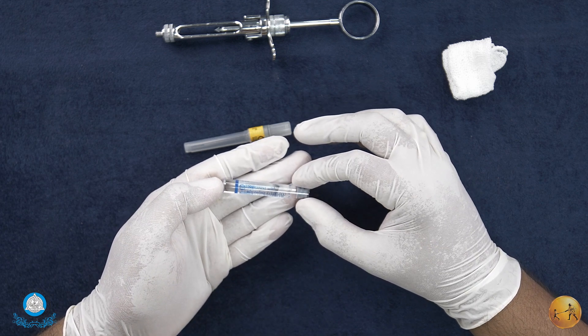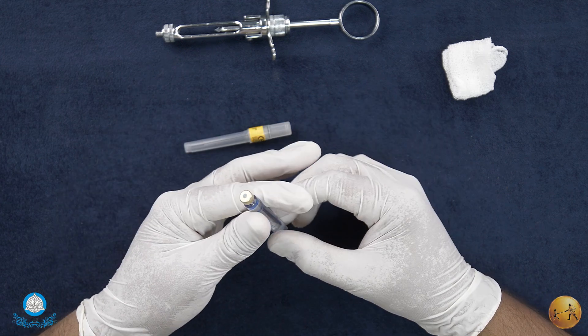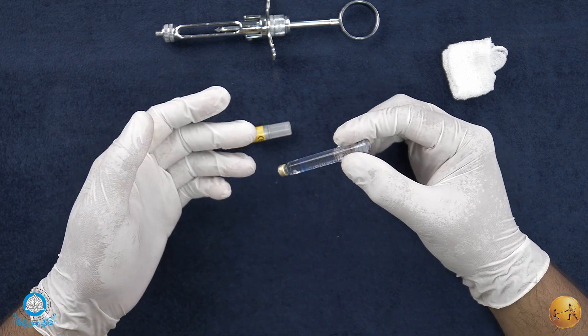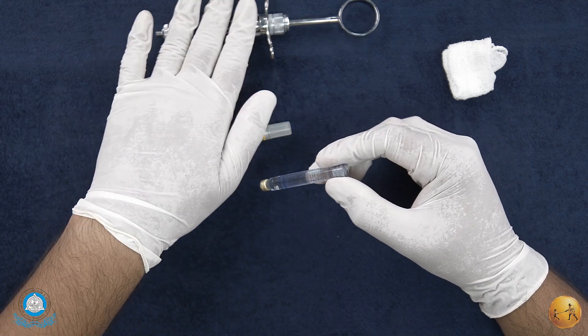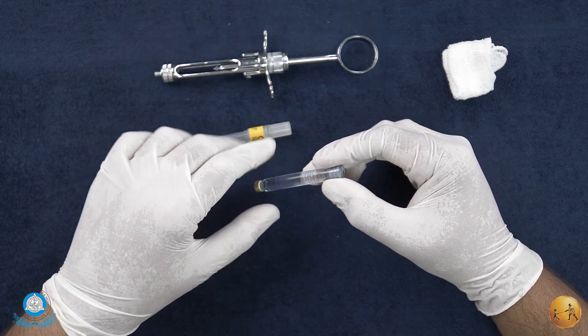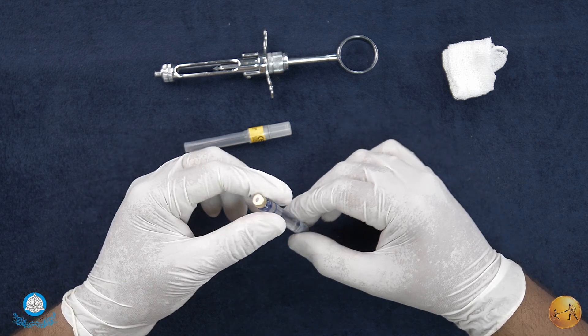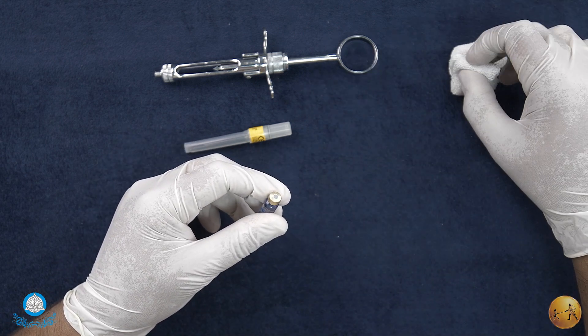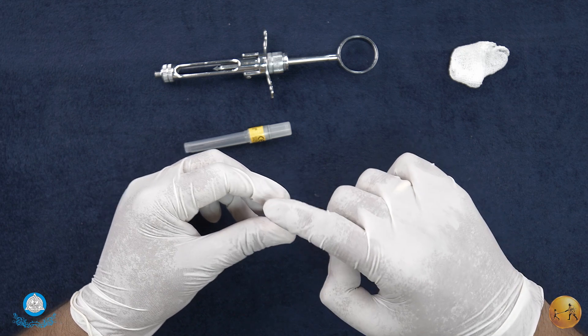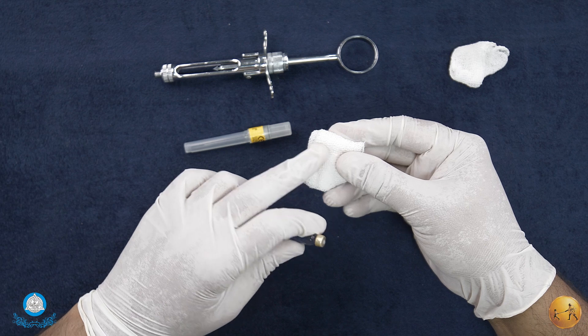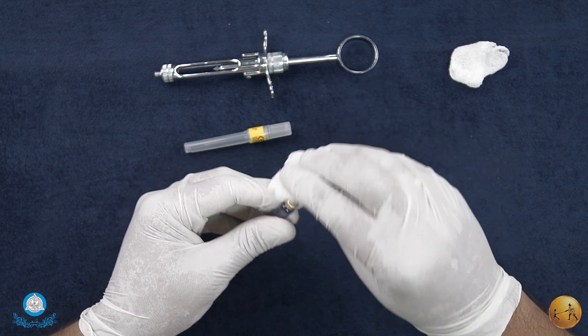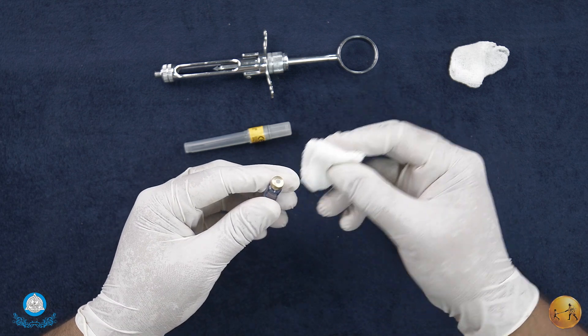A cartridge can normally be used directly from the dispenser to load into the syringe itself. But at times, if the clinician feels like it, the diaphragm - that is the part around the aluminum cap - can be rubbed off using a two by two with either 90% isopropyl or 70% ethyl alcohol.